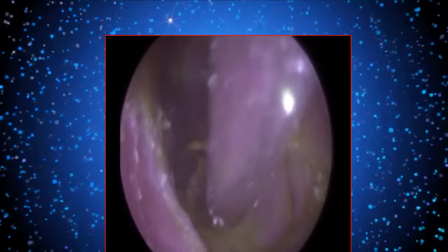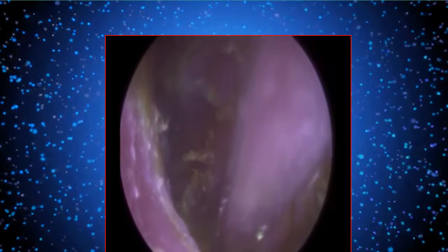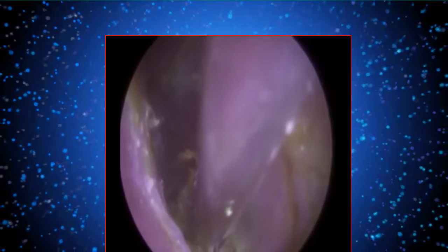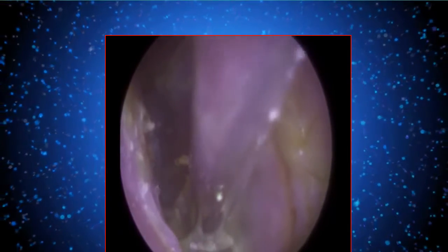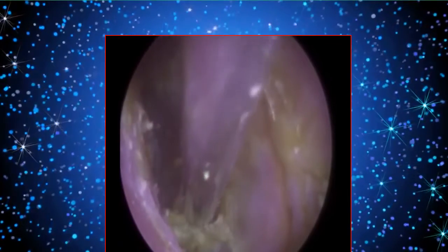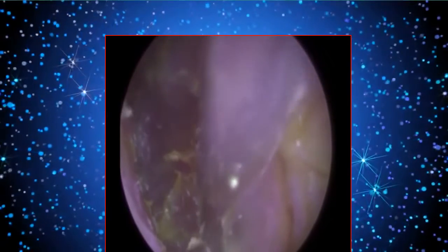It's a bit of a tedious procedure. The fine end kept getting blocked because the dead skin is really gooey and thick, and it doesn't travel up the fine end. It keeps blocking it, so it kept coming out of the ear and unblocking it. And that's important to know when it's unblocked, because otherwise you run the risk of just putting the fine end further and further into the ear. If you think, oh, it's not vacuumed, am I on the dead skin? And you go in further, but it's just blocked. So you've got to be careful, because if you're going too far with the fine end thinking that it's not blocked and you've not made contact with the debris, you could just go through the eardrum.